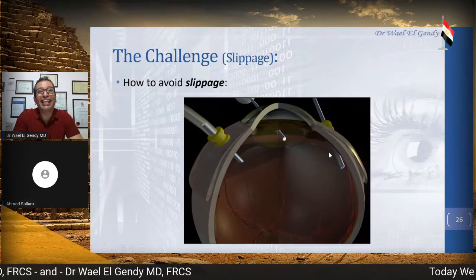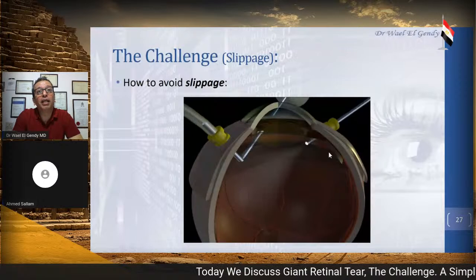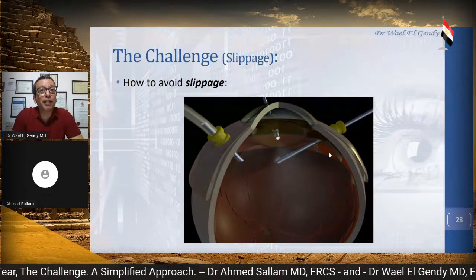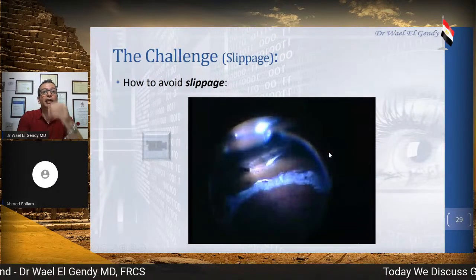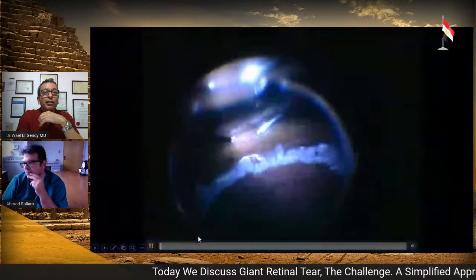You go around in the periphery next to the retina to dry the fluid meniscus all over in every position. And then you aspirate a little bit of the perfluorocarbon, make sure that there is no fluid meniscus around you, and excessively do that. Let's see a video that shows this.